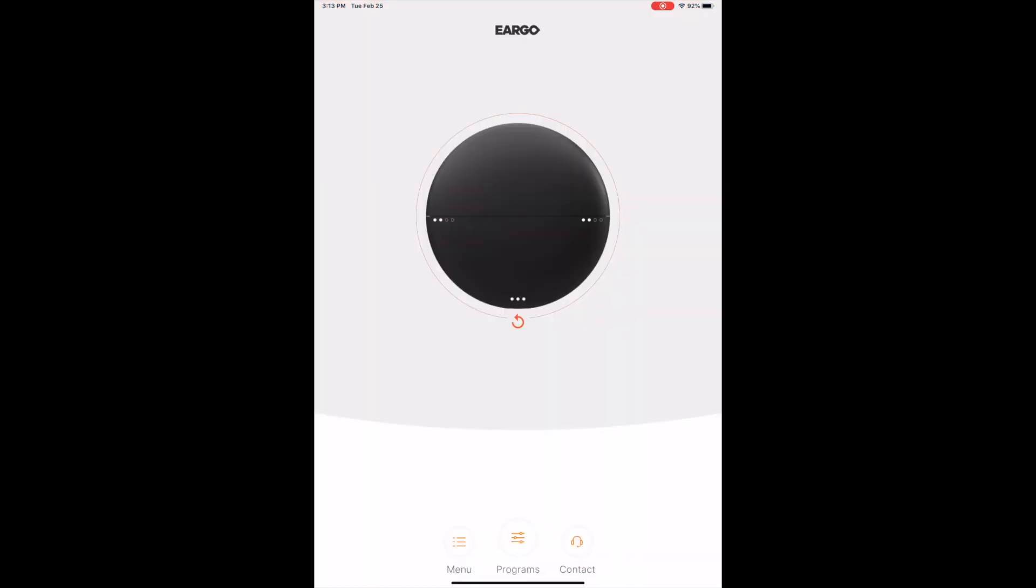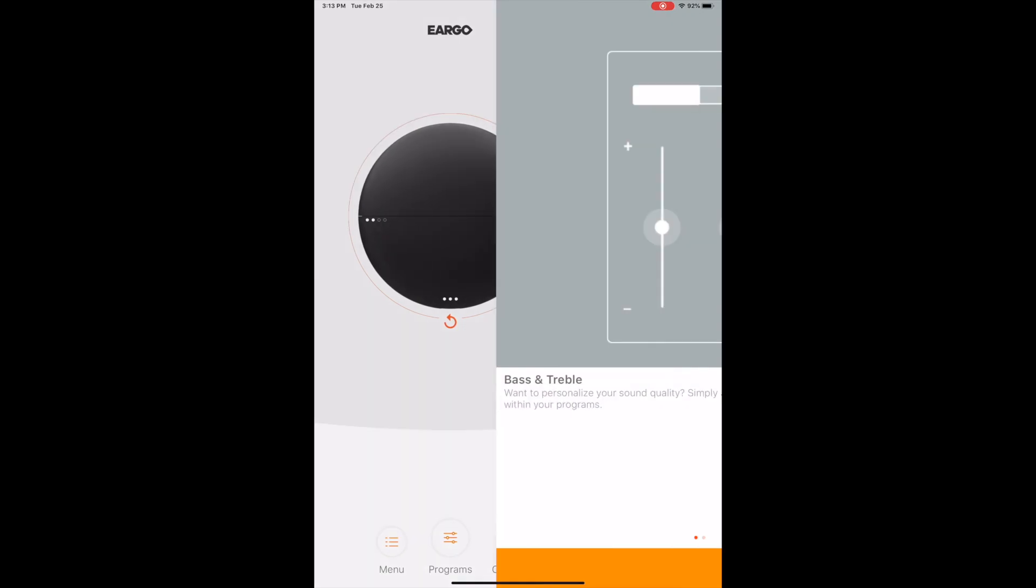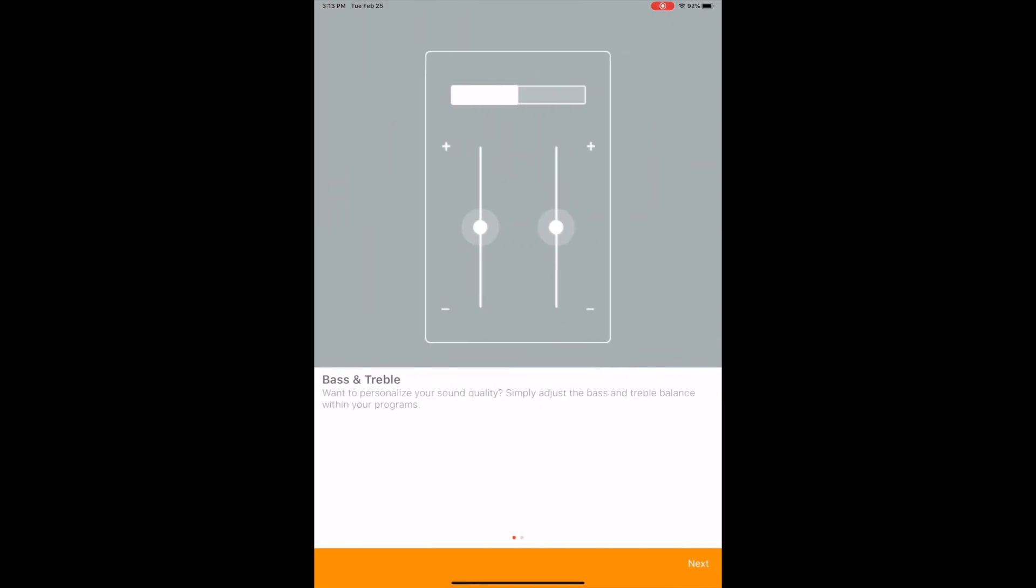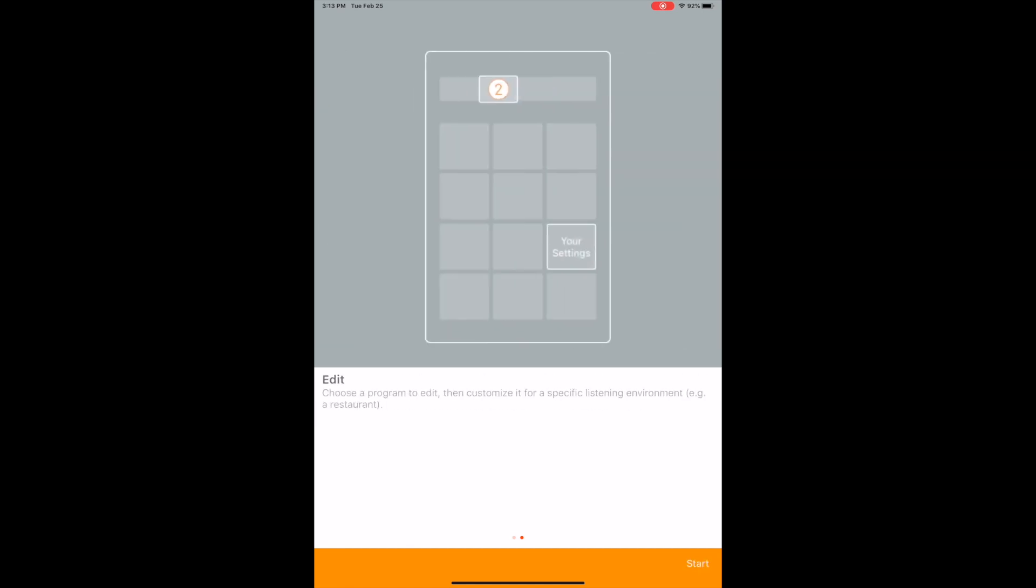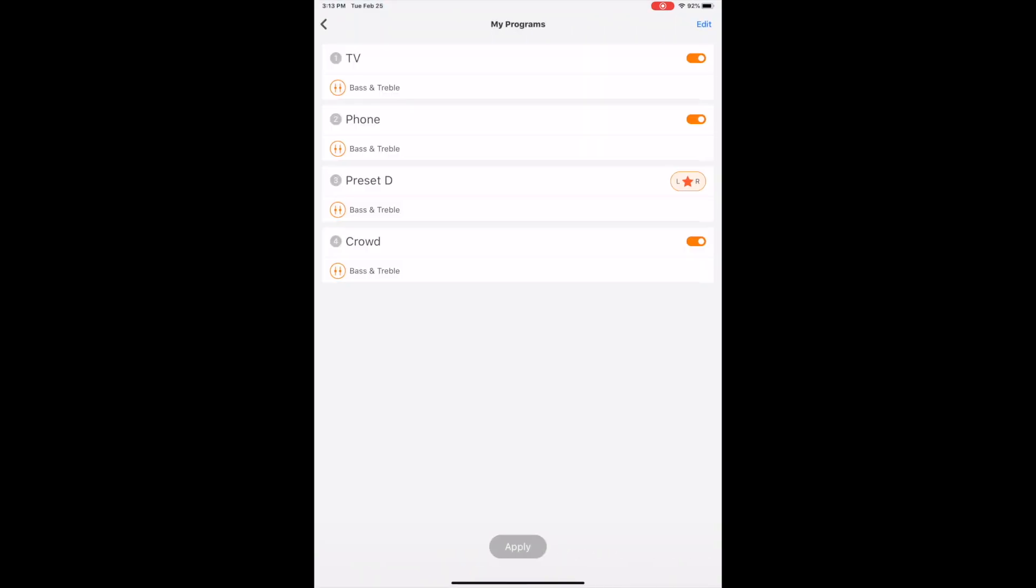But this is the most significant part of it: programs. So when you go into programs you have the ability to go through and do customizations on bass and treble, and then you can edit different program settings for certain or specific listening environments. And then that brings you into the main programming page. Now this is how I have mine set up. I had worked with an audiologist at first and went through to set things up initially, and then they came out with this iteration of the app which really changed things for me.